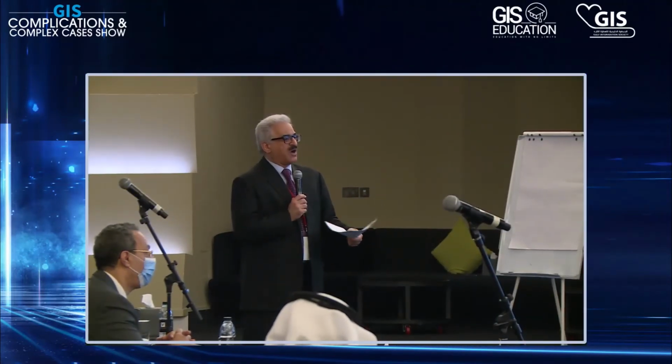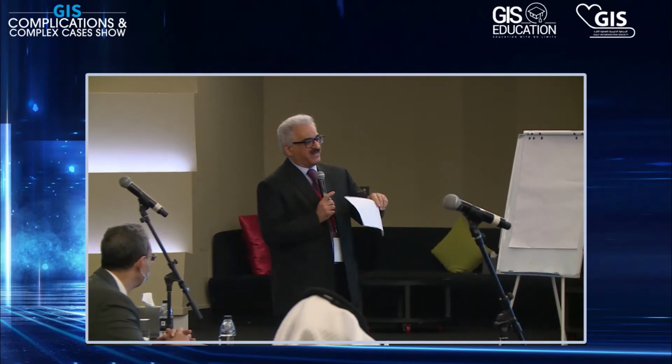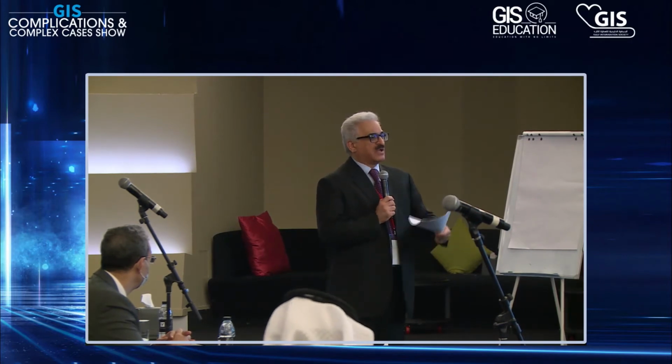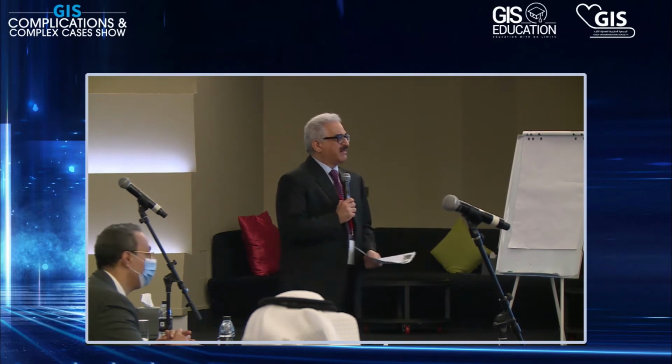So let me ask this: a common thing. He of course did an overview of wire catheters and the rotablator wire, but usually when the wire gets stuck in the calcified region, what are the tips and tricks? And also when we do bifurcation and the jailed wire, when we pull it out, especially after we do the POT, what are the tips and tricks to pull it out safely without breaking the wire?